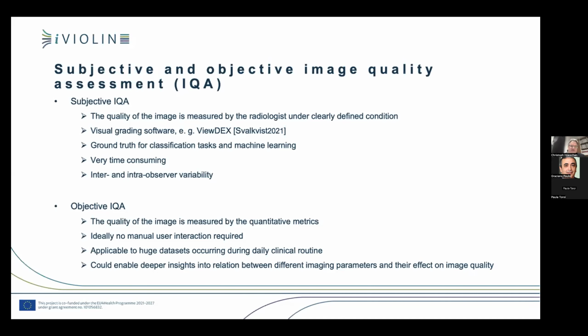You have heard a lot of uncertainties with the talk of Paula. And here we again have quite a bit of uncertainty and the results unclear. So that is the subjective image quality. But I also want to make one point that I think is very positive about subjective image quality, because this really reflects the clinical case. So that is where you are when you look for the radiologist reading the images. This is also, he's reading that subjectively himself.